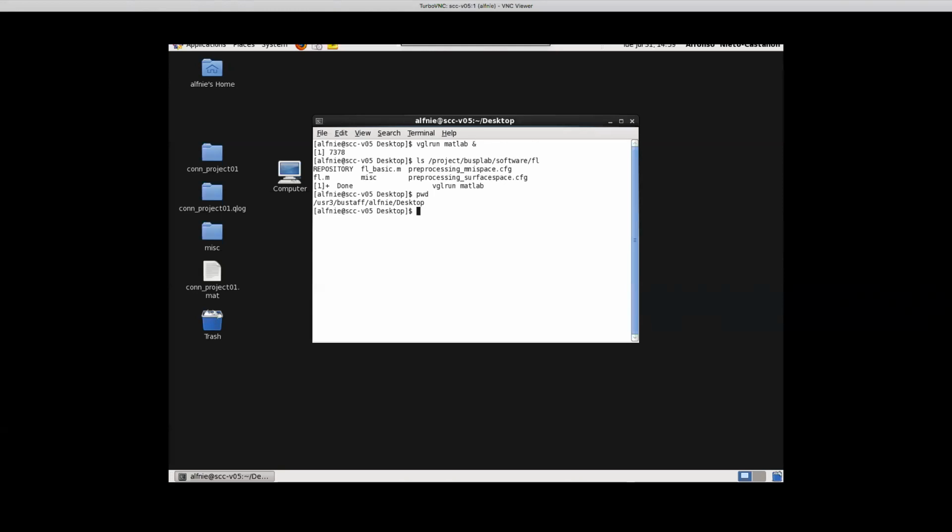So I don't know if this helped a lot, but the reason why I was mentioning these things is because there is not that much of a difference between the surface level data on the original number of vertices that FreeSurfer gets and the surface level data on the FS average space. It's just a matter of looking at exactly the same surface, the same triangular tessellation. It's just resampling it so that the dots, those nodes in the spherical representation, are in exactly the same place, and they have relatively similar sized triangles. I don't know if that clarifies or not.